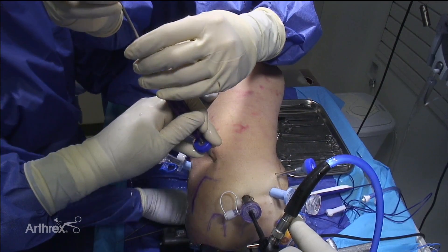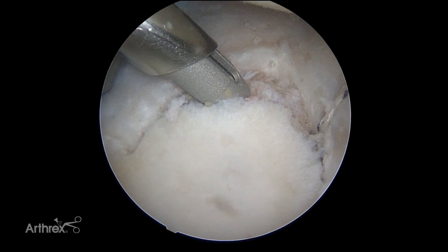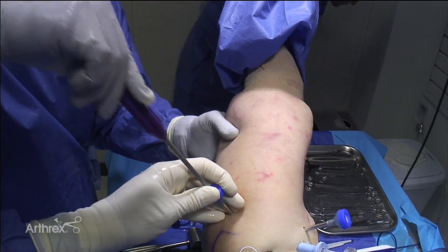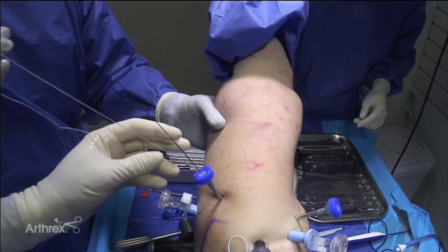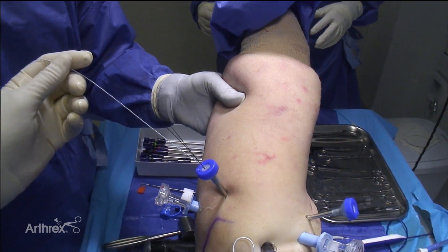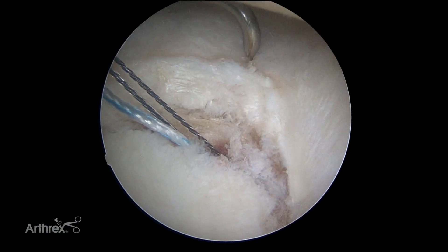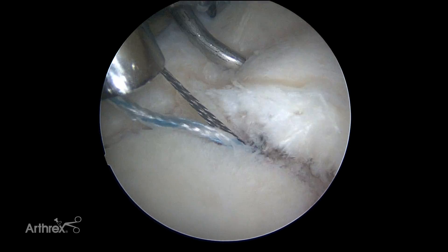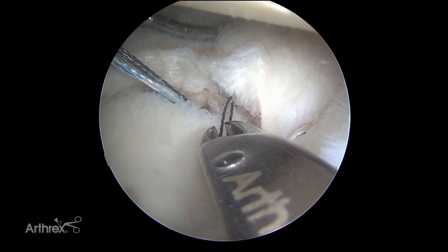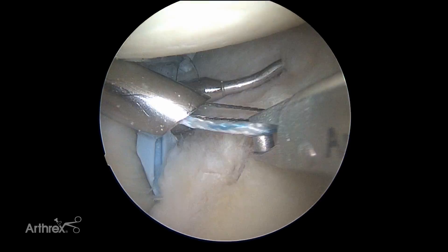For a six o'clock anchor you need to do it from a posterolateral portal. We put the anchor down and remove the spear. Looking out through the cannula, we have two nitinol limbs — one with a loop and one straight. We need to pass the suture through the labrum and thread it through the anchor with the nitinol. Using the quick pass suture passer, I can get right down at six o'clock to pass this — you don't want to go real deep, just feel it pop through. Bring limbs out one at a time to avoid tangling, then use the tape retriever to pull through.